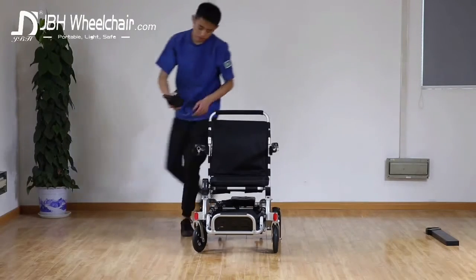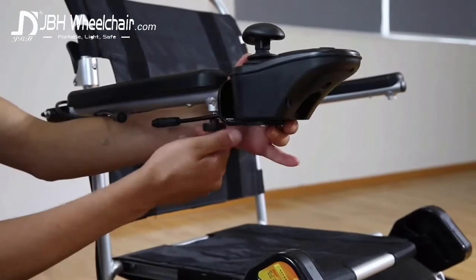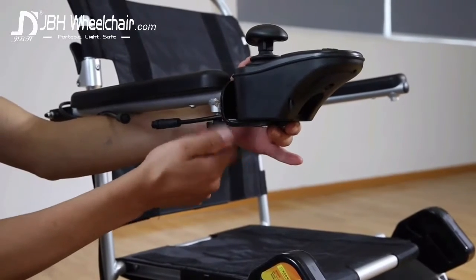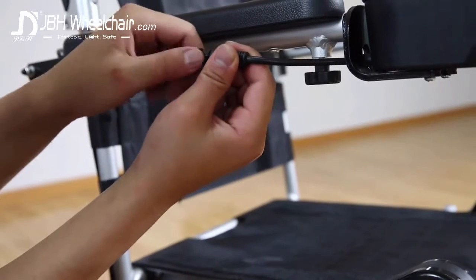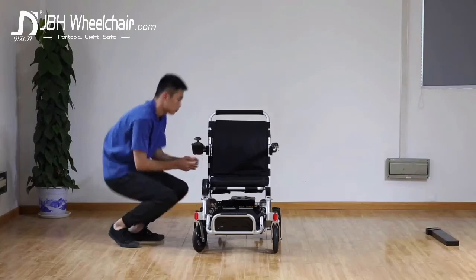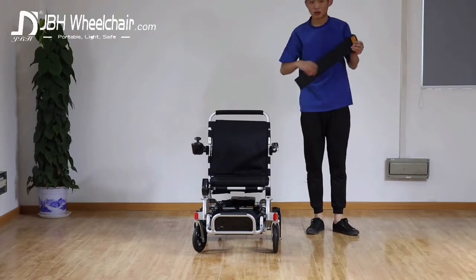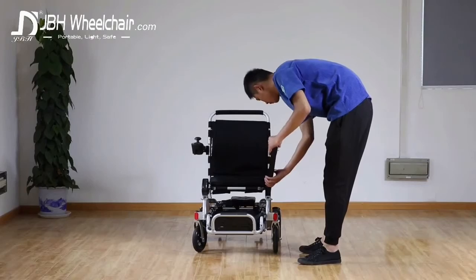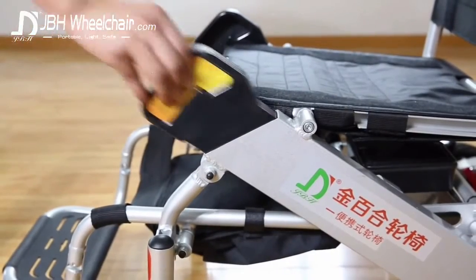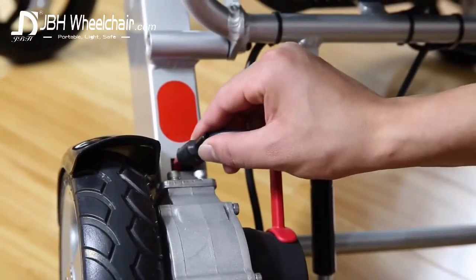The joystick has a simple screw-on mechanism which is easy to access but ensures the connection will not be lost even on the bumpiest of roads. The cleverly placed armrest battery simply slips into place in one easy movement, and this then plugs snugly into the chair body.